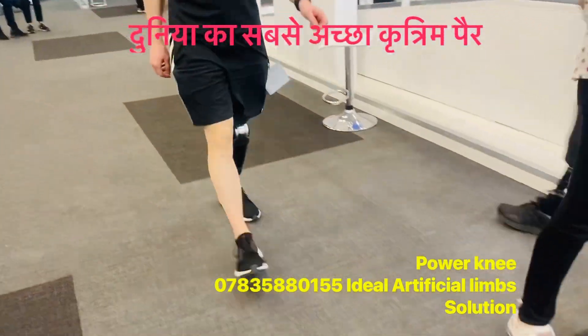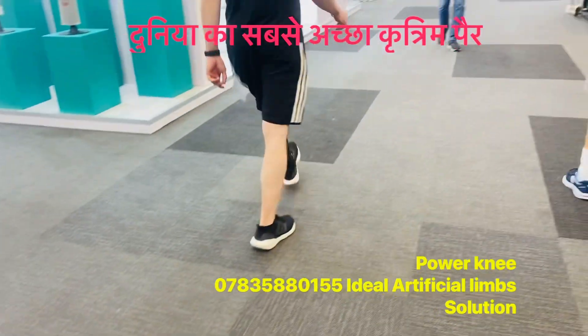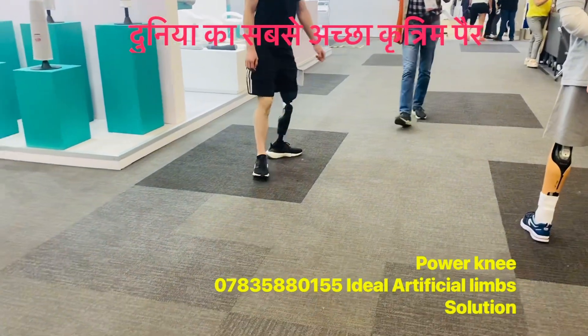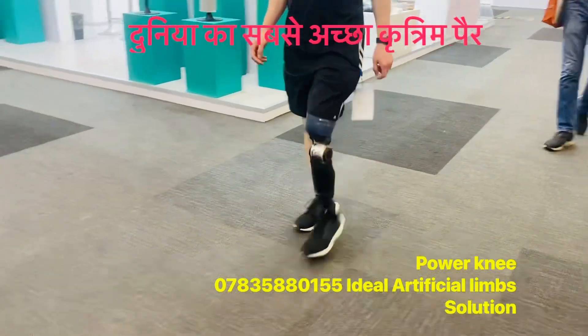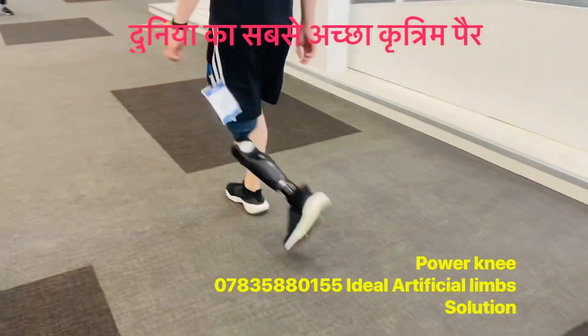Can you see the step length? It's very similar because the motor makes the degree be achieved — the functional degree. The motor helps to get the extension and flexion. But the motion of degree.